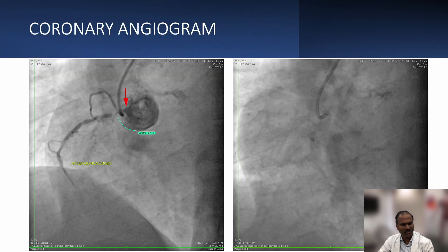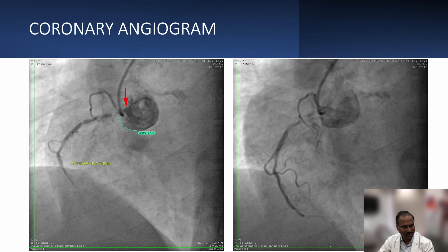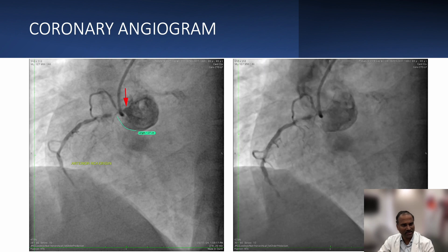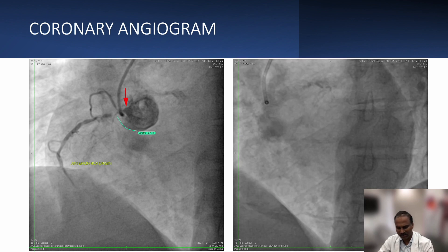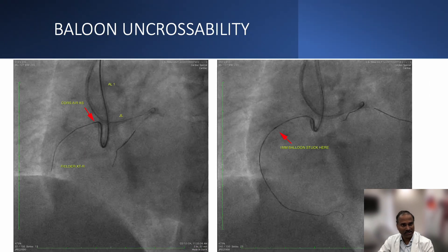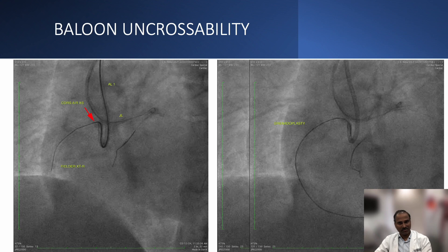Moving to the second case: the right coronary artery has an anomalous origin from the anterior part of the sinus — the origin is quite deep inside, so it's an anterior origin. Whatever guide you use won't become coaxial for further intervention. These are cases where you can anticipate difficulty in wiring, advancing anterograde gear, and even rotablation. You can see how the guide was sitting — we nose-dived with Corsair to wire the lesion. A 1 mm balloon was stuck and could not advance beyond the lesion; there is tram-track calcium present.